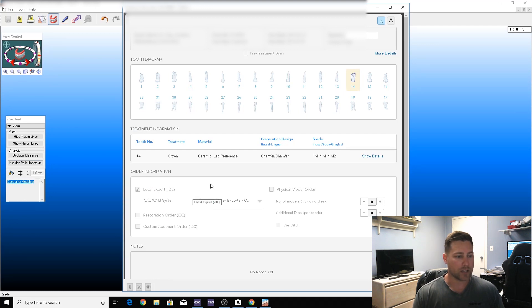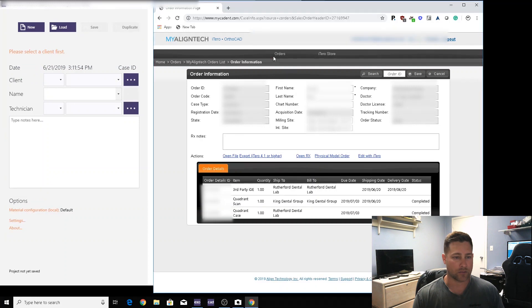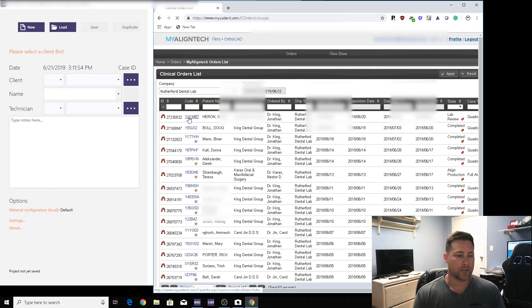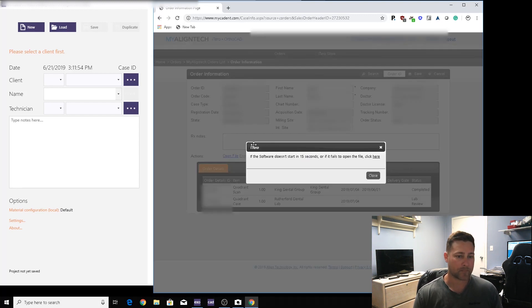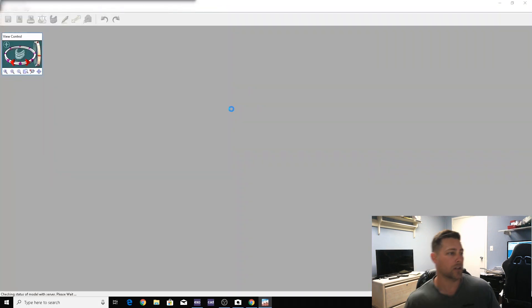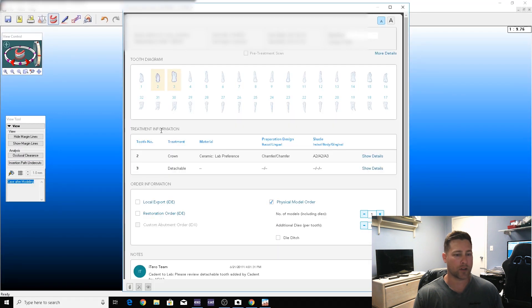Since I've already done this case, let's do a different one. Exit out, open a fresh file — I have not done this one. We'll open the file here and it'll load depending on how fast your computer is. Then we'll open up the RX.